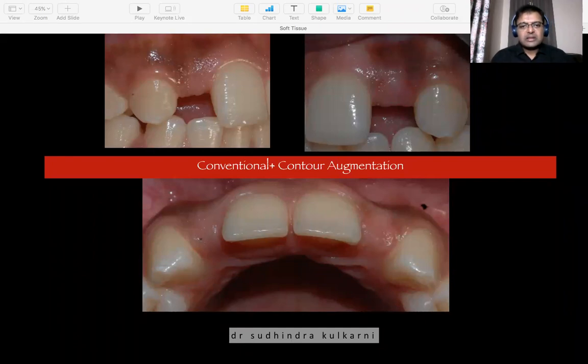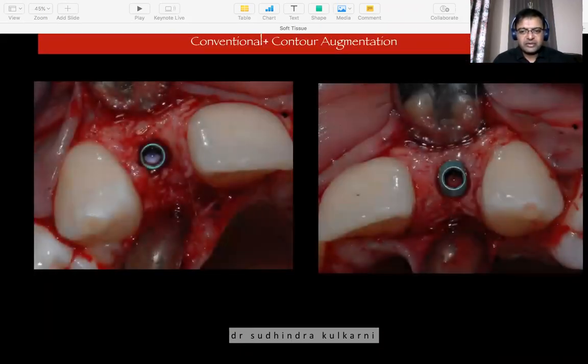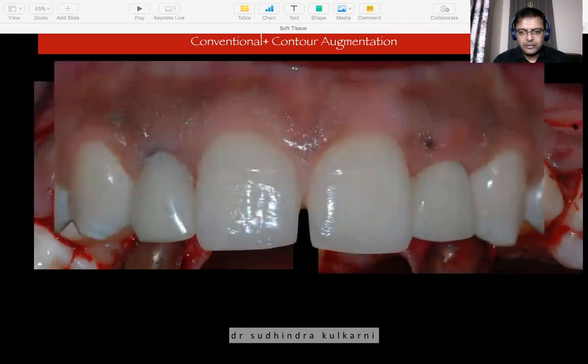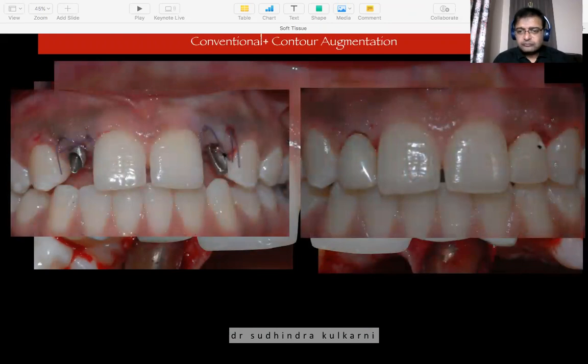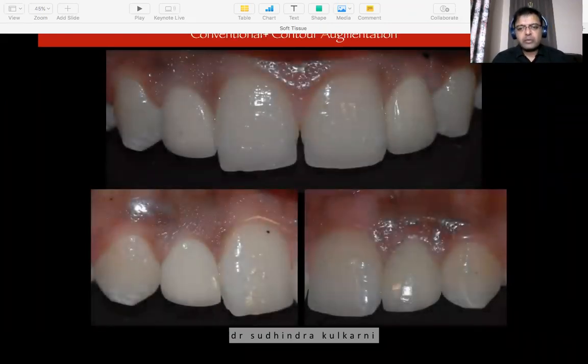Let's look at this case. Again, congenital missing lateral incisors. Let's skip the surgical part, regular implant placement, and temporization, and then the final restoration. This is how it looked on the day we had done the final restorations, and after probably a month of follow-up. At the time of this, you see that the tissue around the implants looks very good. On both the lateral incisors, 1-2 and 2-2, you see beautiful stippling, and I thought it was excellent.